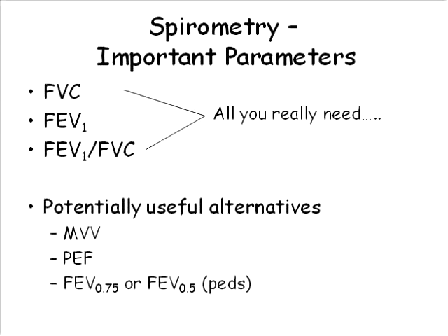We can probably relate that we need to get acceptable and repeatable spirometry. And those of you who do pulmonary function testing as part of your daily routine will recognize that although this seems like a very simple approach, it can be difficult to get acceptable and repeatable spirometry on many of our patients. But again, if we can get a good forced vital capacity, and if we can get an acceptable and repeatable FEV1, then we can really calculate most of what we need in terms of helping the patient in deciding whether or not obstruction is present and whether or not additional tests might be needed.